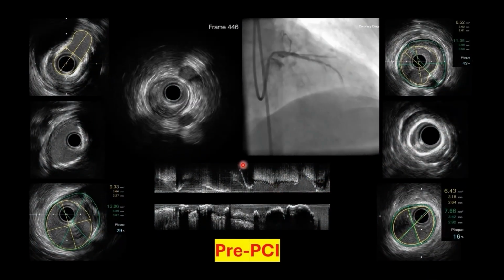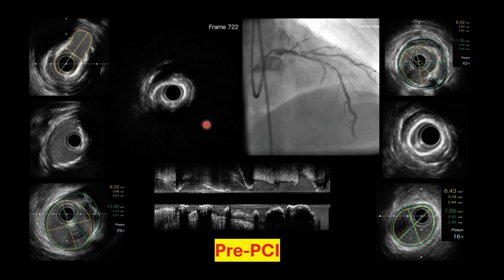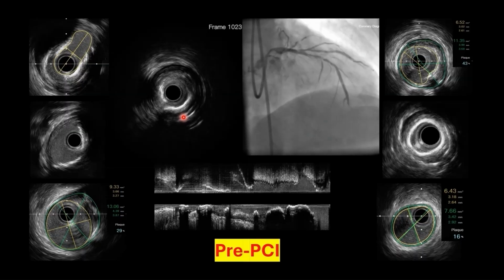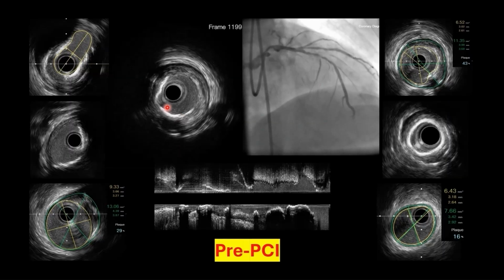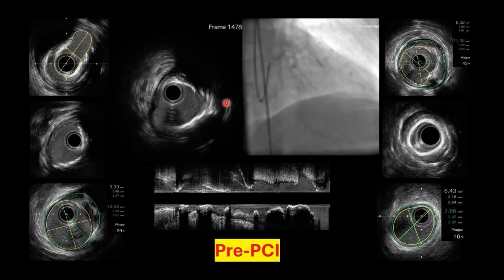We can see on IVUS, the mid-LAD has a long and severe 360-degree calcium, which is very hard to modify by just balloon angioplasty or even a cutting or scoring balloon, but this is a perfect target for intravascular lithotripsy. In the proximal LAD and left main, we can see a large calcium sheet which extends from superficial, which we can see on IVUS, to a deep layer we suspect on angio.